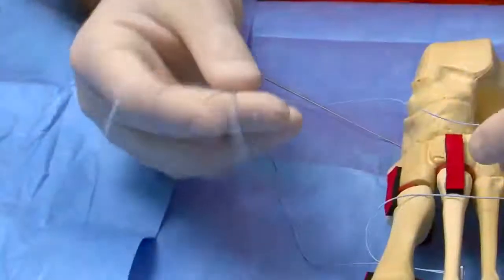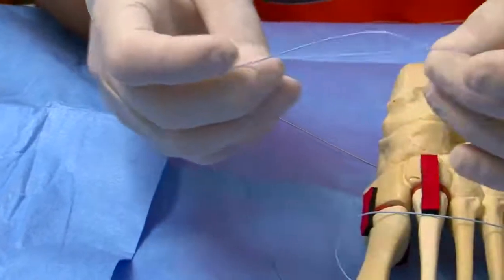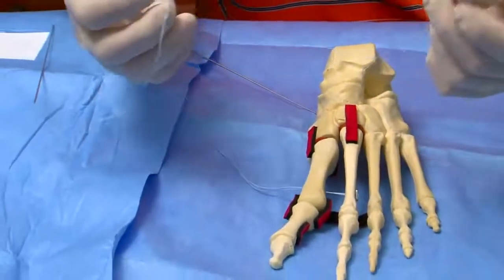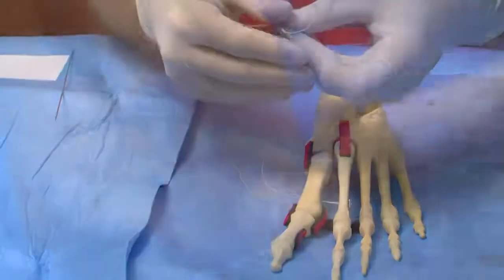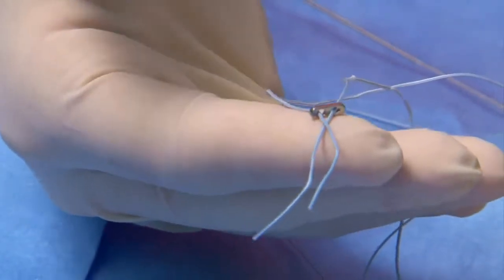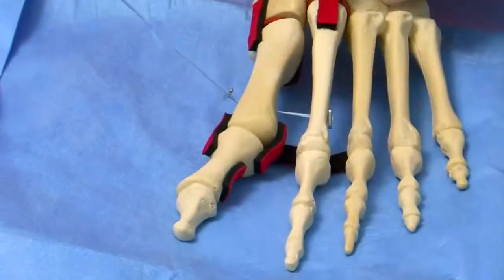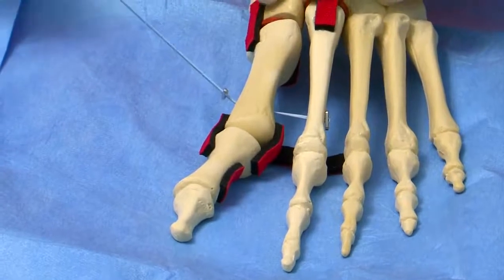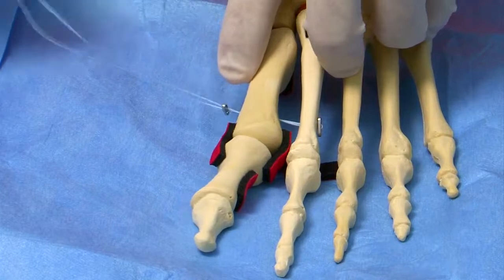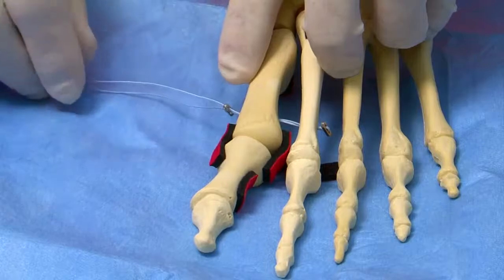Once the fiber wire is passed through the first metatarsal, the linked portion of the tails can then be separated, and the oblong button will then be threaded on to these two tails. Once the oblong button is threaded on to the two tails of the fiber wire, the button is then placed onto the medial aspect of the first metatarsal. The intermetatarsal angle is then reduced, and 4 or 5 square knots will be thrown to secure your reduction.